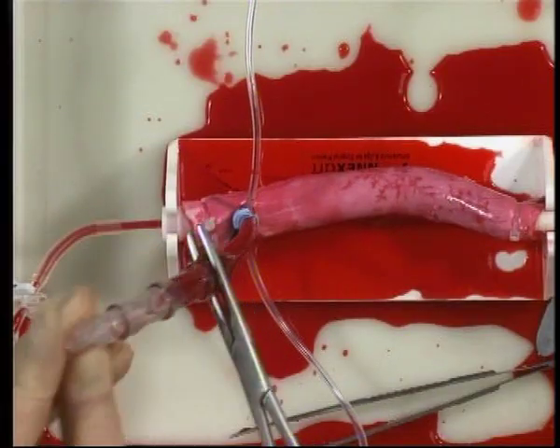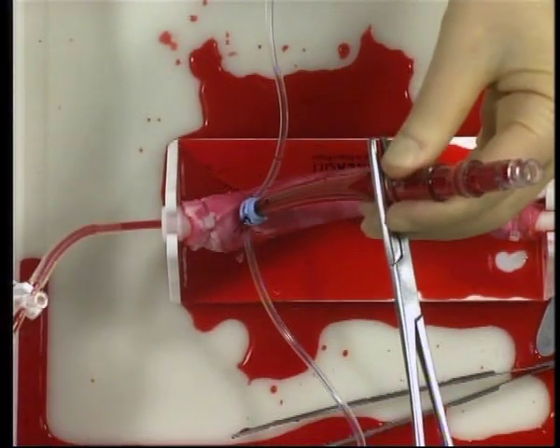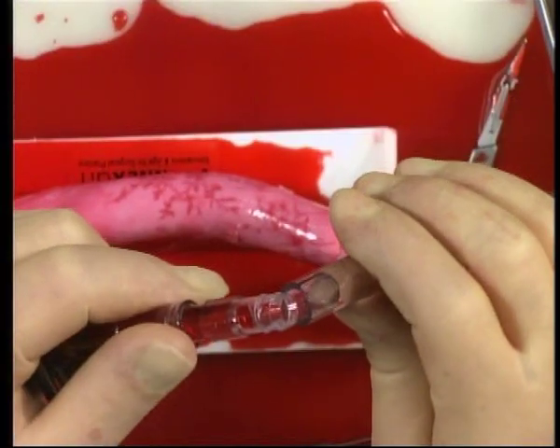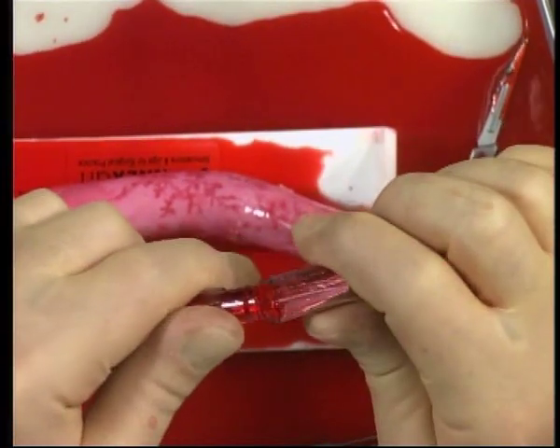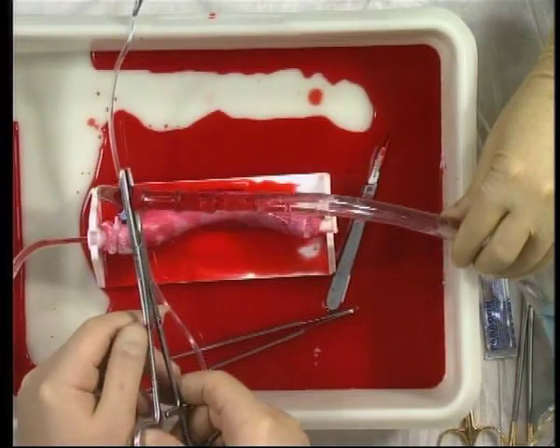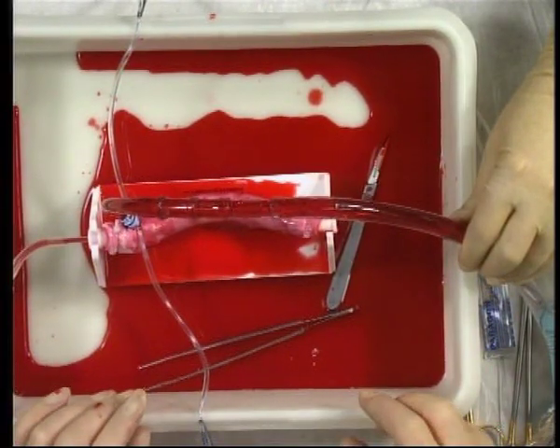The clamp is released to allow the cannula to fill with blood and expel any air. The arterial line from your bypass circuit is now brought up. The clamp is removed and the tubing allowed to slowly fill with fluid. Once the tubing is full and air has been expelled, the tubing is joined to the arterial cannula. The system is checked for air and the clamp is then removed from the arterial cannula. Arterial cannulation and connection to the bypass circuit is now complete.